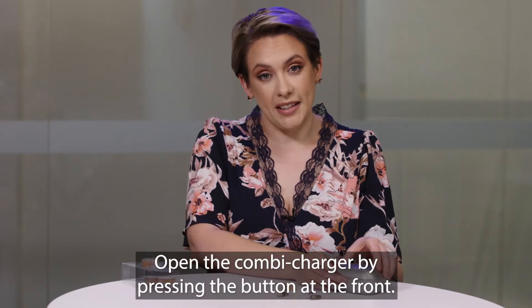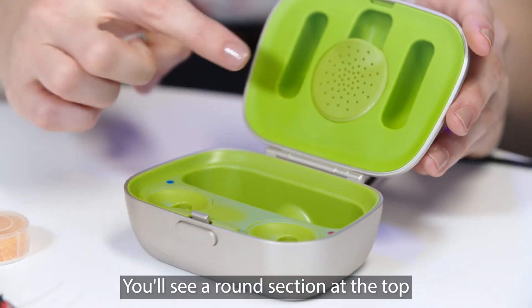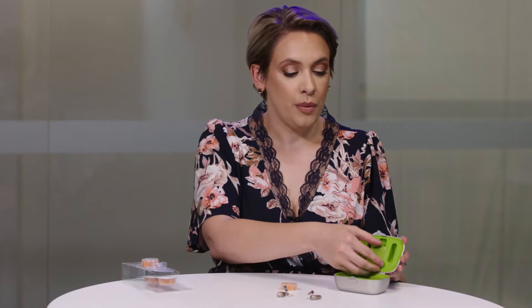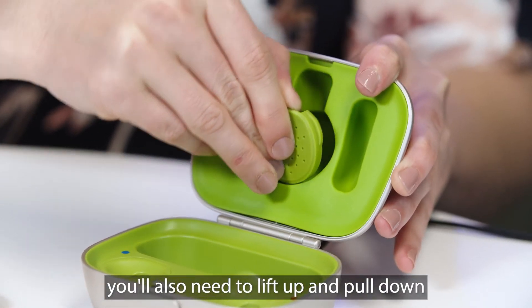Open the combi charger by pressing the button at the front. You'll see a round section at the top where you can put your drying capsule. Pull firmly to open this — you'll also need to lift up and pull down.